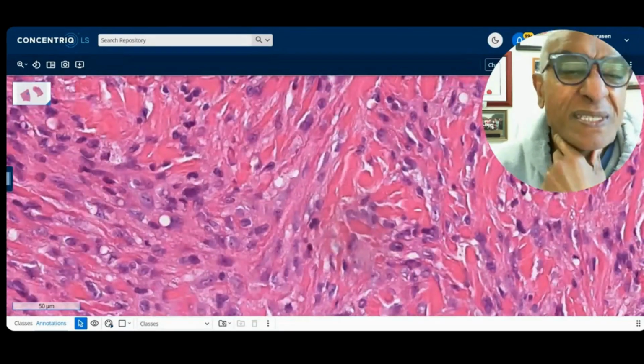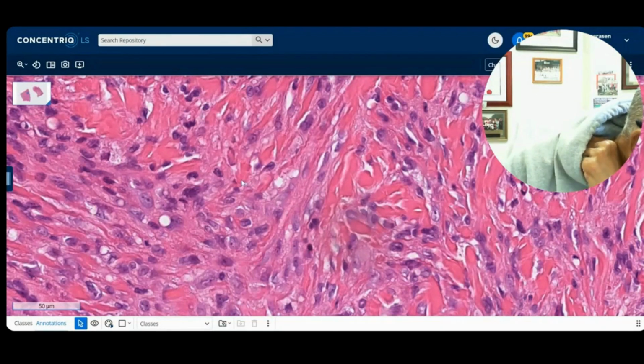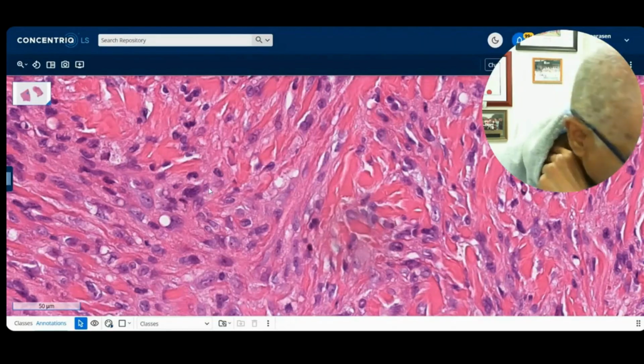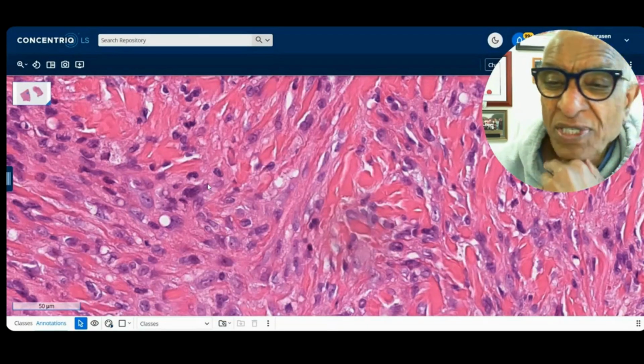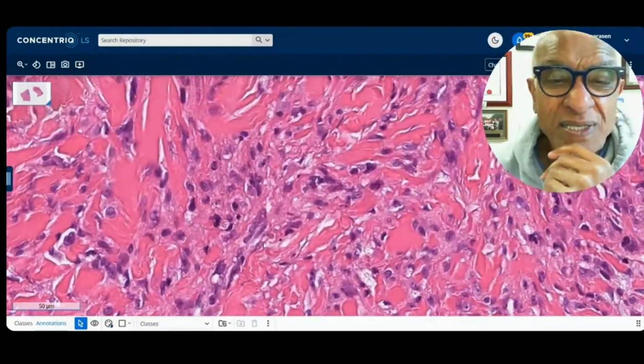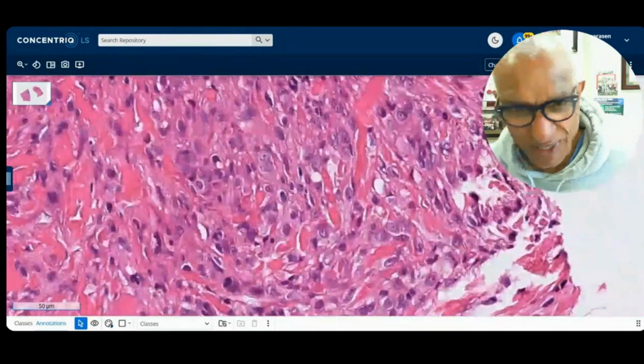Any thoughts so far? So we have a scrotal mass in a 41-year-old. This was a punch biopsy of his scrotal mass. And this tumor is lying in the dermis of this skin biopsy. Just to give you a better impression of these. This is much better as well.